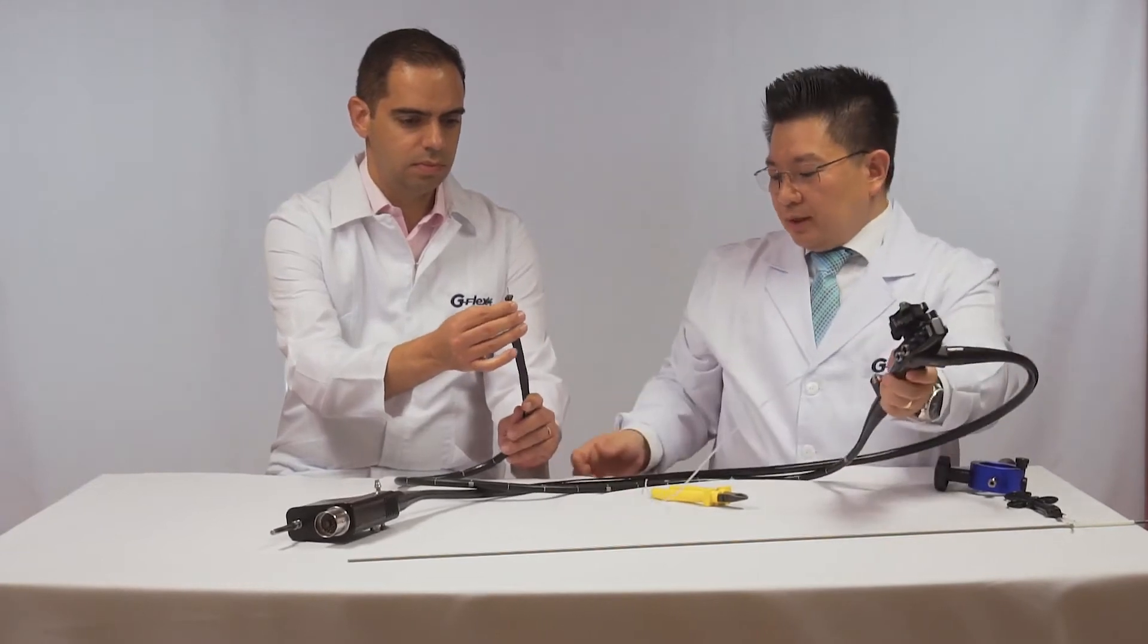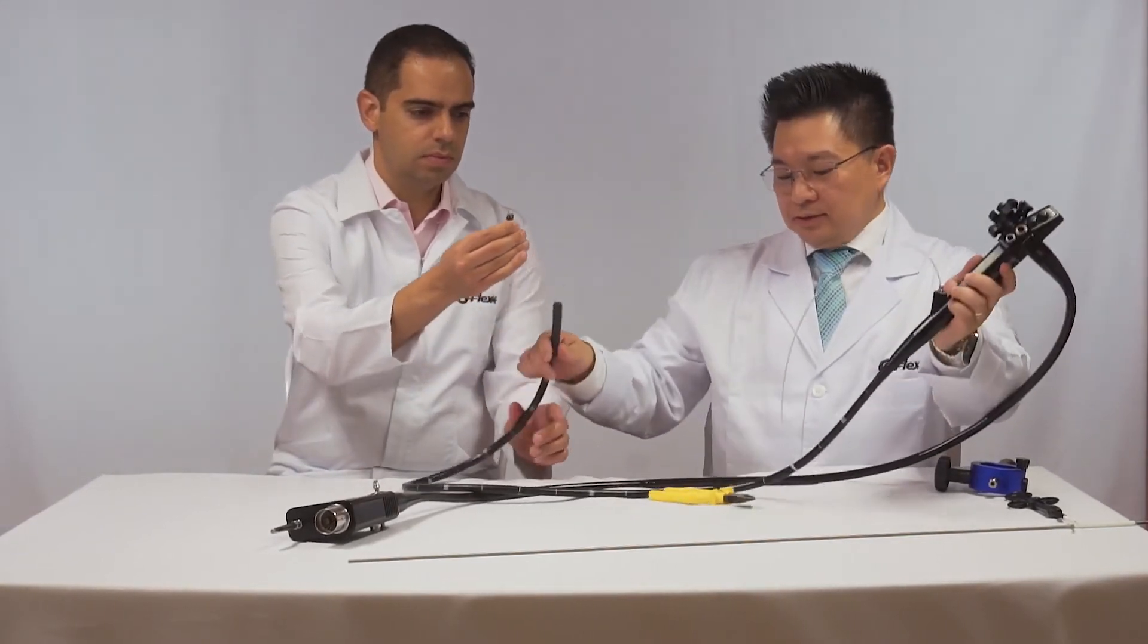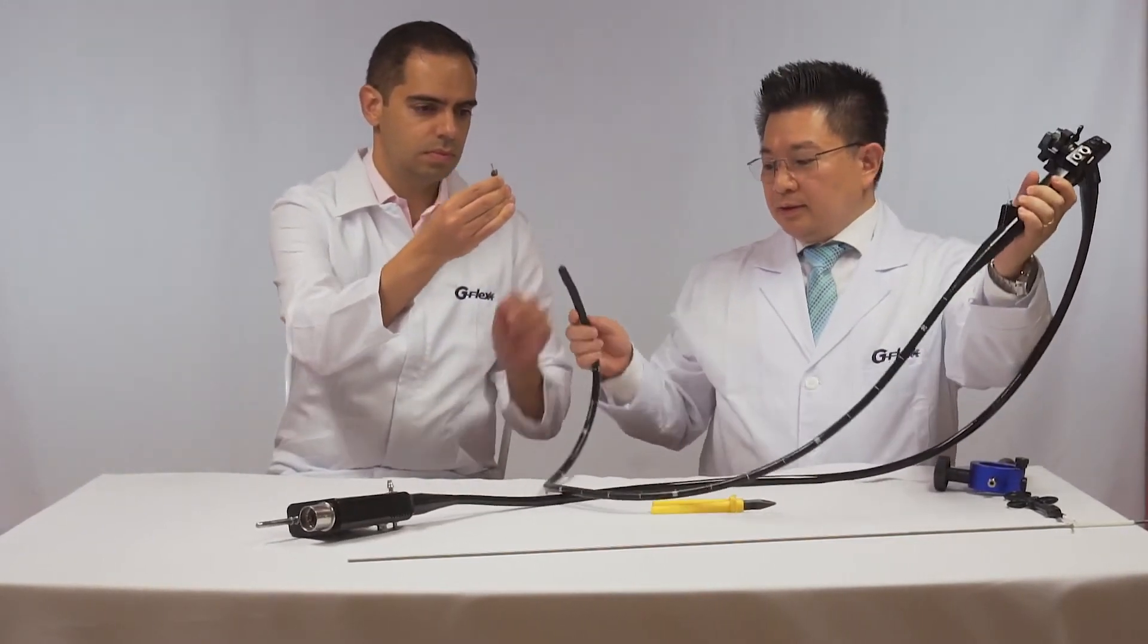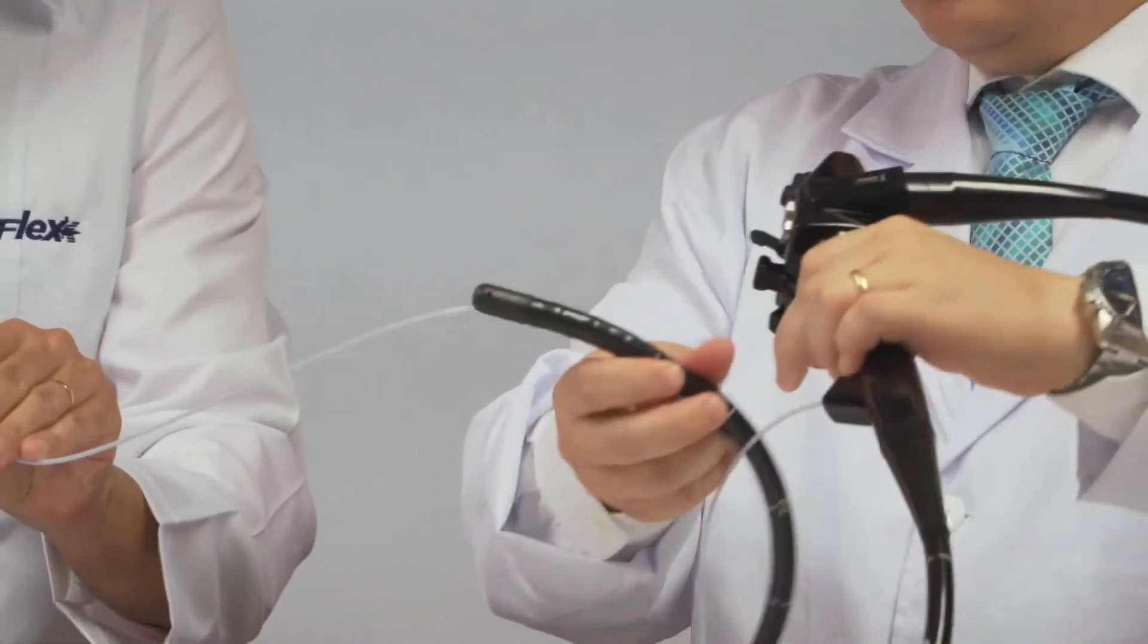You need to pull out the duodenoscope leaving the basket like this.